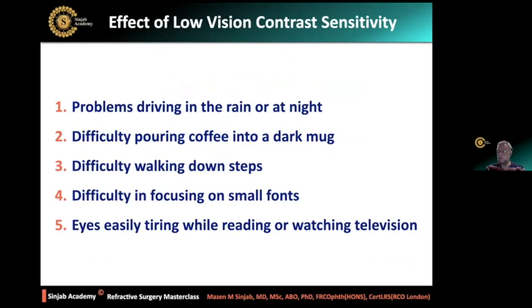So this is very important, of course, in refractive surgery, because it is very well known that when we do corneal refractive surgeries, we are affecting the contrast sensitivity. Of course, in different amounts, based on how much we are treating, what technique we are using, and so on. The laser profile, of course, the laser spot profile, energy, size, a lot of things.